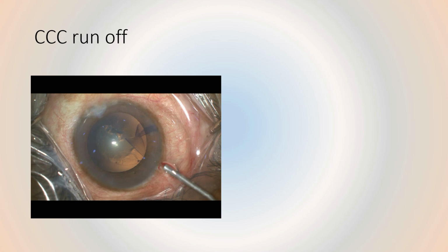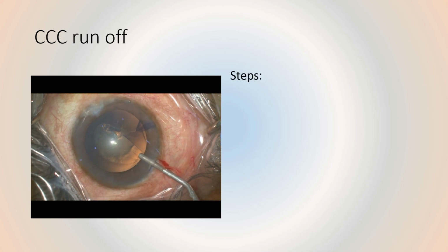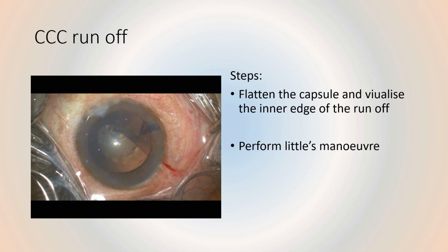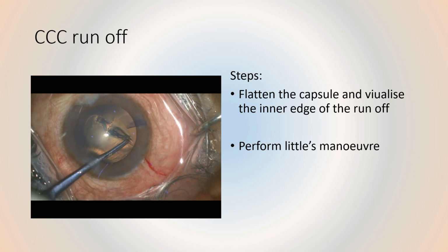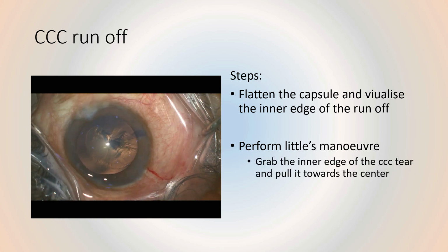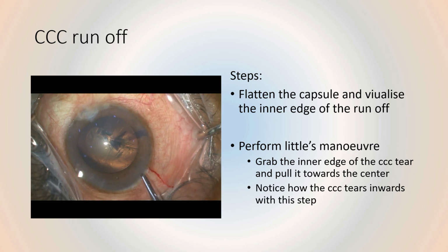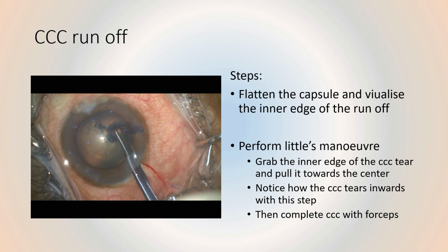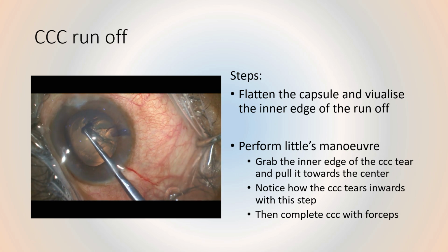What to do in case of a rhexis runoff? Flatten the capsule and visualize the inner edge of the runoff. Perform Little's maneuver. Basically, grab the inner edge of the tear and pull it towards the center. Notice how the rhexis tears inwards with this step. Then complete the rhexis with forceps.